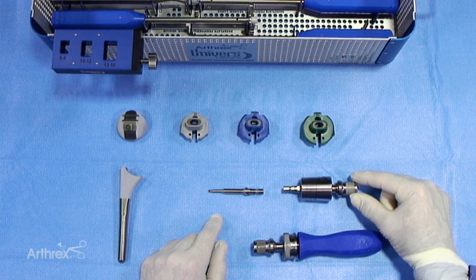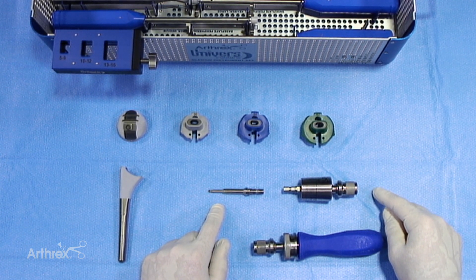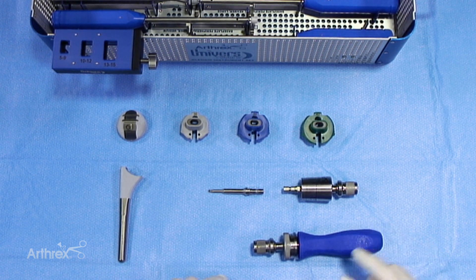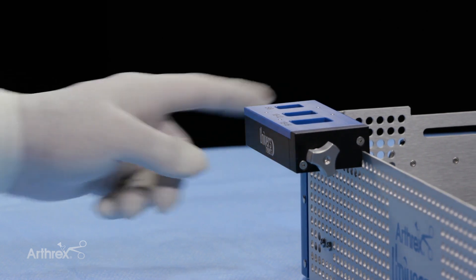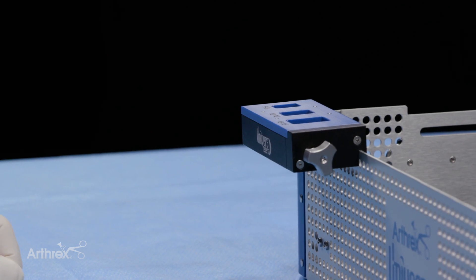We have a torque indicating adapter into which the screwdriver goes, so that we can properly create the amount of torque necessary to have this well fixed with the locking screws, and of course the handle. And then finally, to hold this in place so that the surgeon doesn't have to do this in free space, we also have the assembly stand which can be connected to one of the trays in the back, which helps hold the stem while you're fixing the cup securely onto the stem.